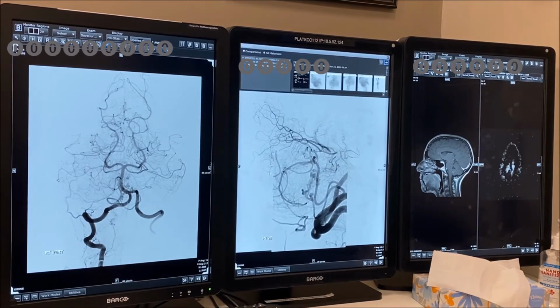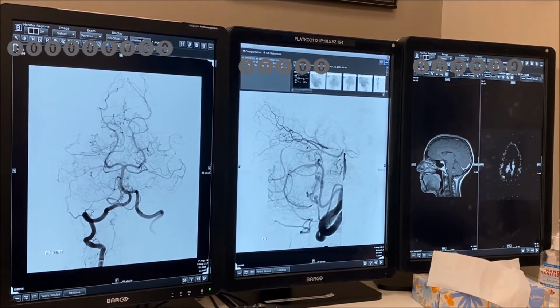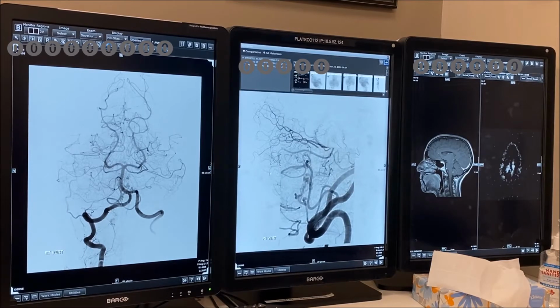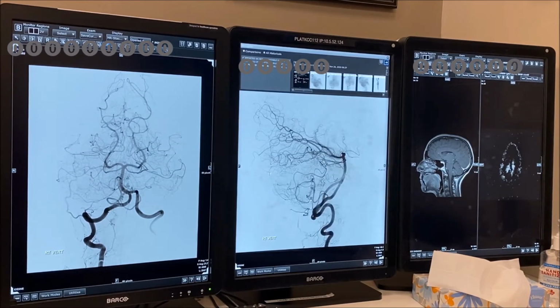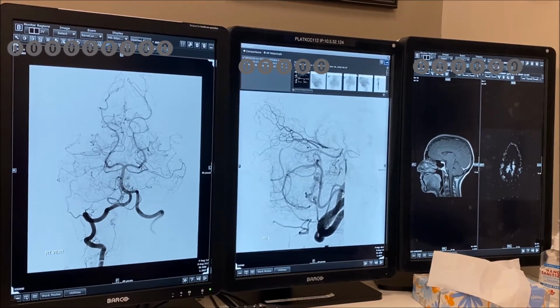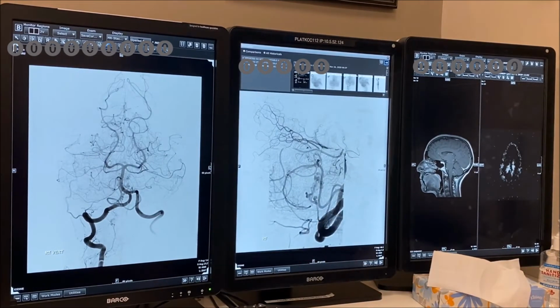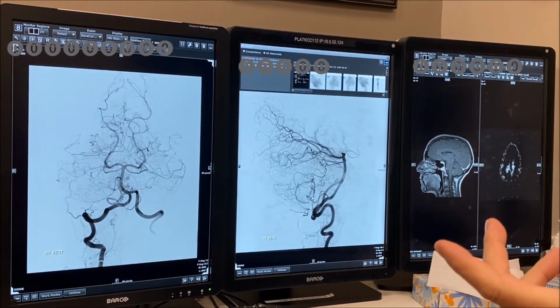It's like an aneurysm, right? And then you have another one here. Yeah, it looks like another aneurysm. And then you got a whole bunch of these things that look like multiple aneurysms. But in addition to that, there are channels, right? I have one artery here, one artery there, right? As soon as you see that, the next question is, is there an early draining vein?